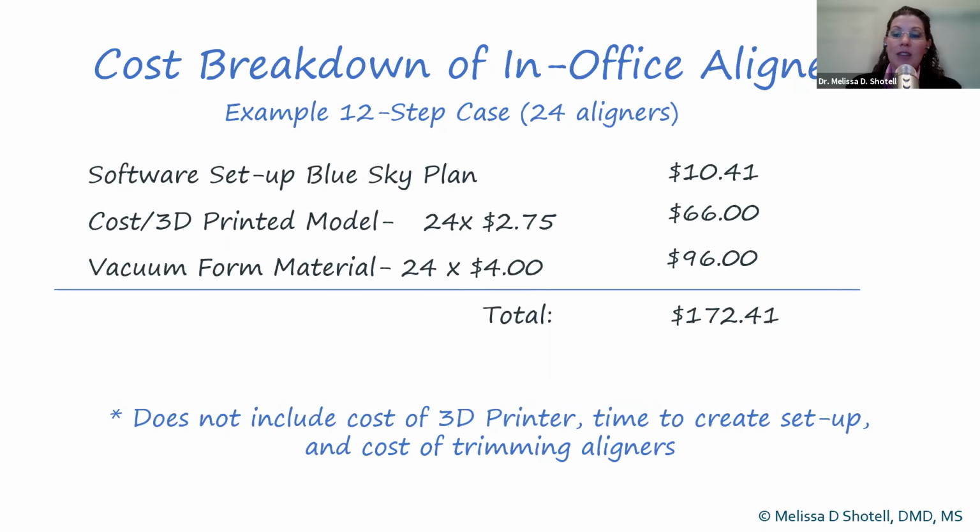Now, I know in my office, I do have a laboratory technician, and I do have several assistants that are trained to trim aligners. And I know how much they're paid per hour and how many aligners they can trim in an hour. So I can easily calculate from there in a case what my cost would be when I'm calculating and setting a treatment fee for a patient. And I know for many of us on this webinar today, many of us already own or utilize a 3D printer for other things within our practice. So this is really just expanding the use of equipment that we already own.